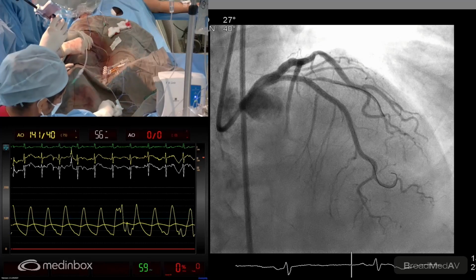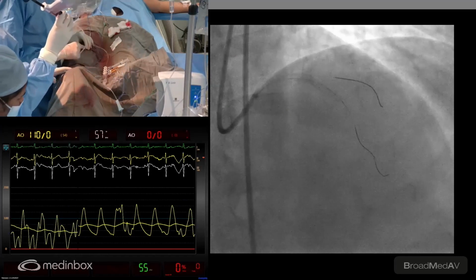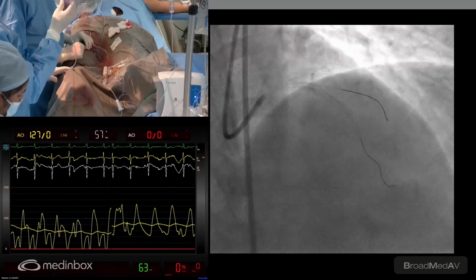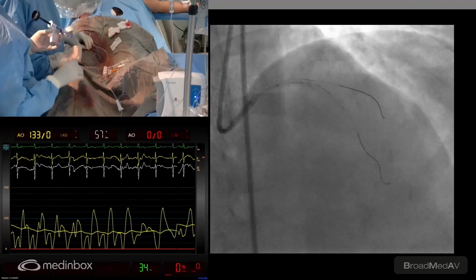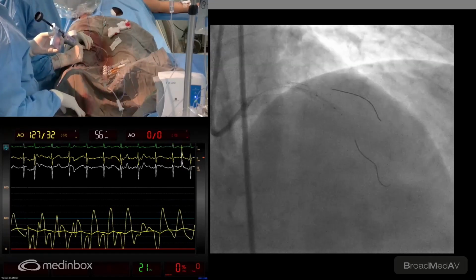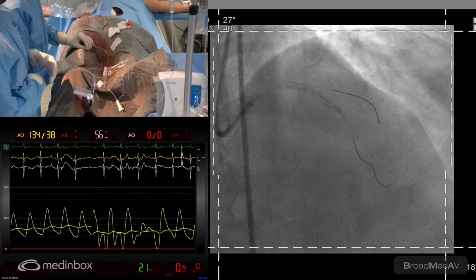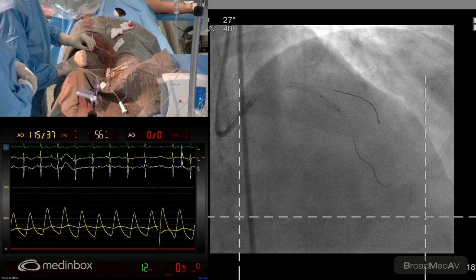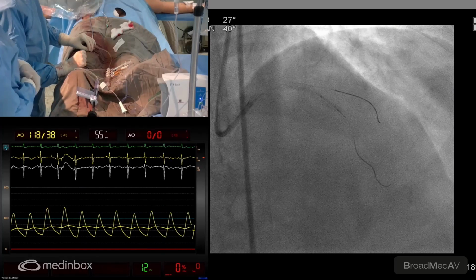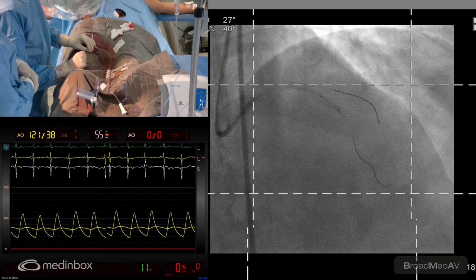So Rahul is asking me a question whether we should remove the wire in the diagonal when you're doing the proximal. I don't think anything will happen, even though it's a hydrophilic wire. We'll just take a stent boost here. Ready?